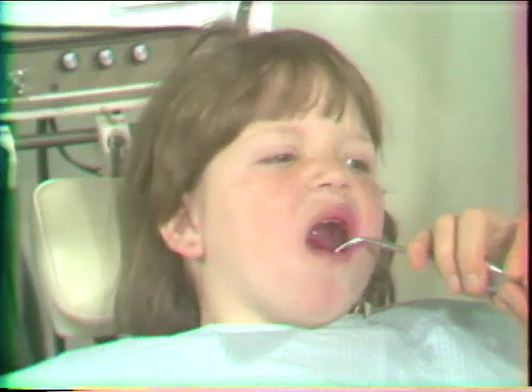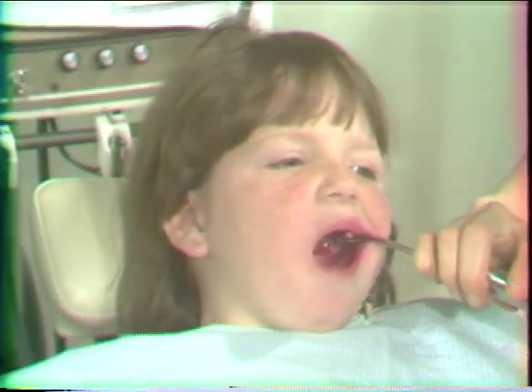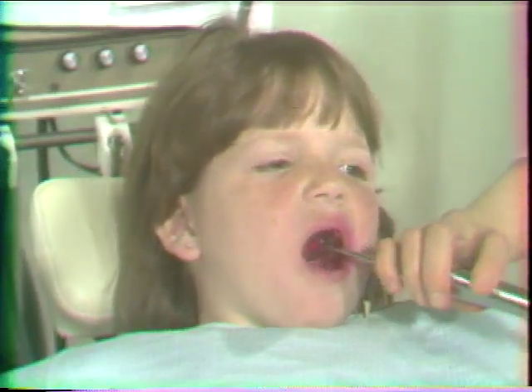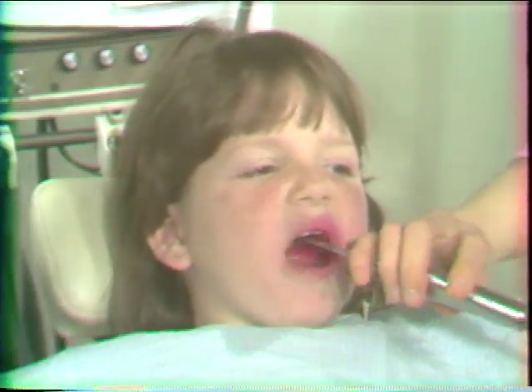When the quadrants of the teeth are isolated and the fluorides topically applied, the same time limits are applicable. The single rinse technique, which is acceptable. First, dispense solutions as above.